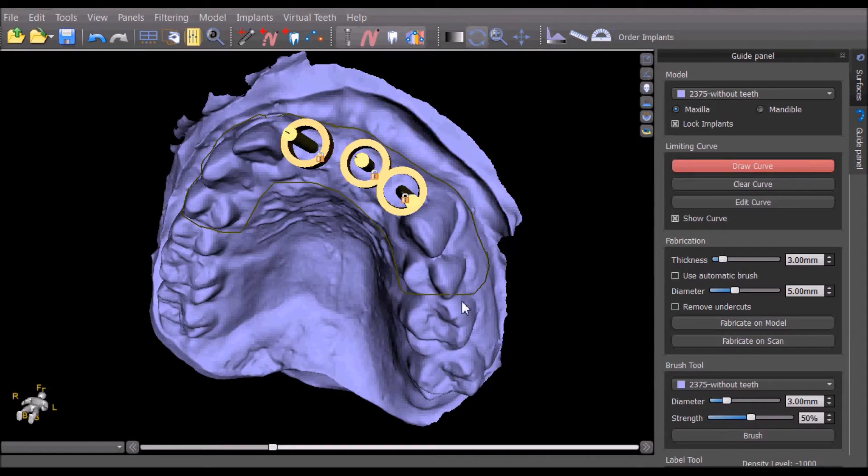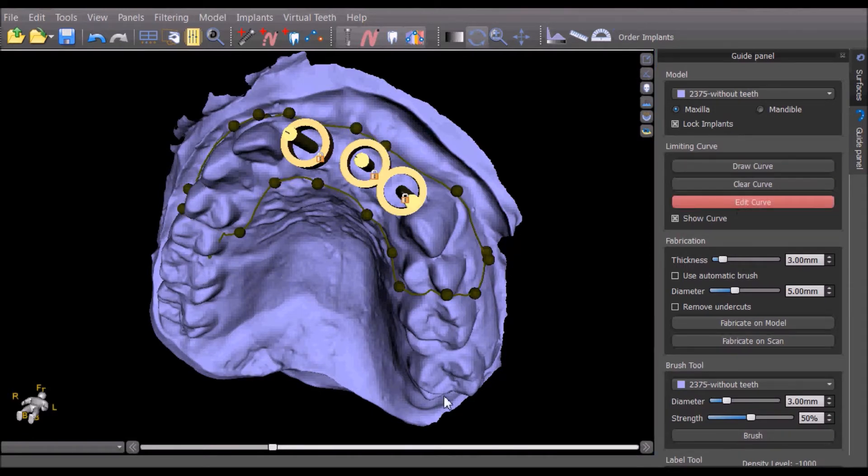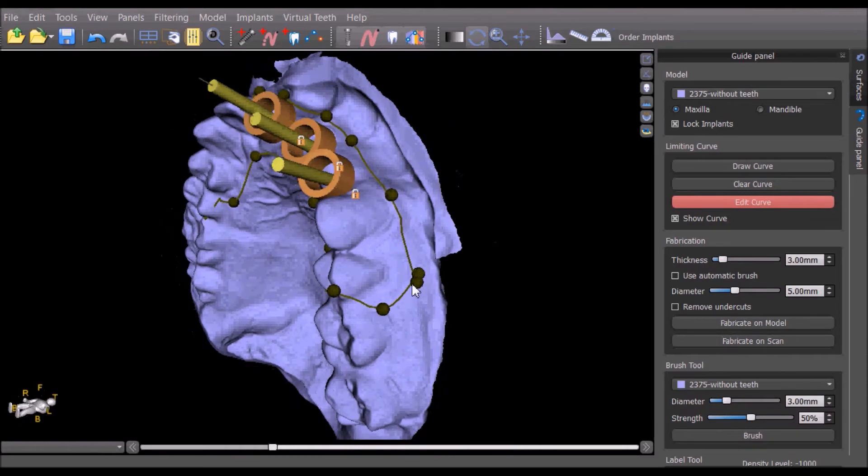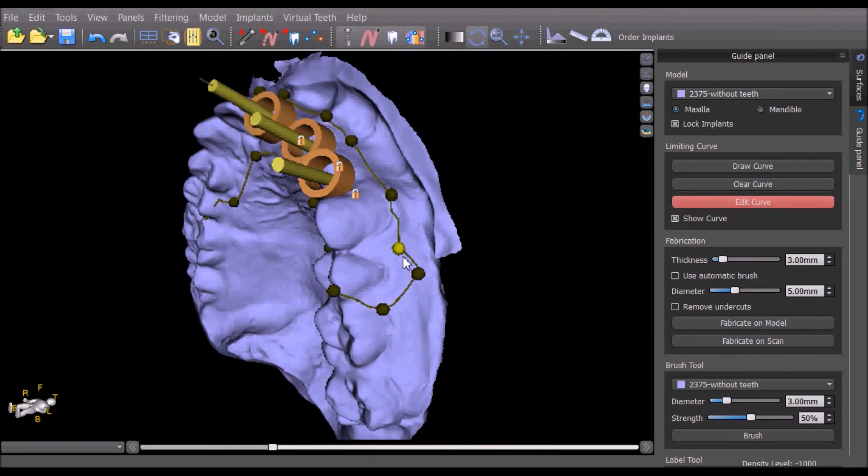After we have completed drawing the curve, we can press the Edit Curve button to review and modify the positioning of the curve.